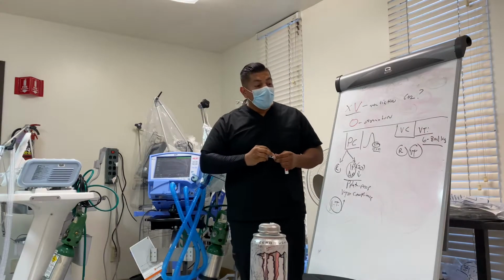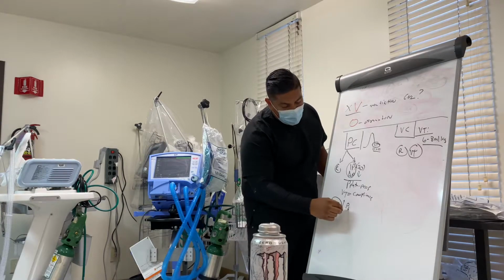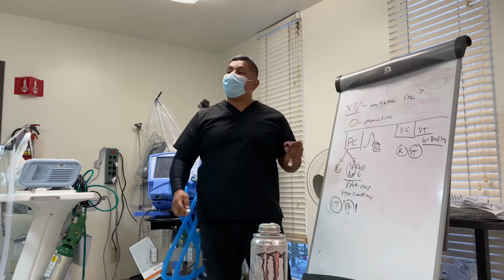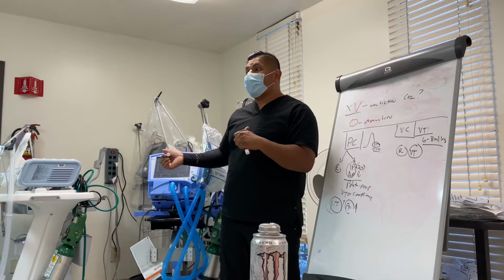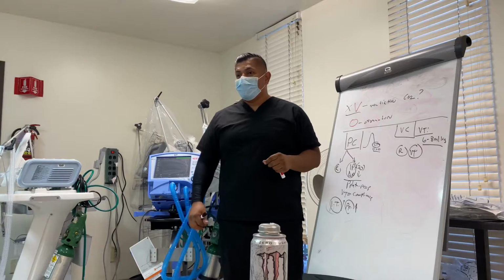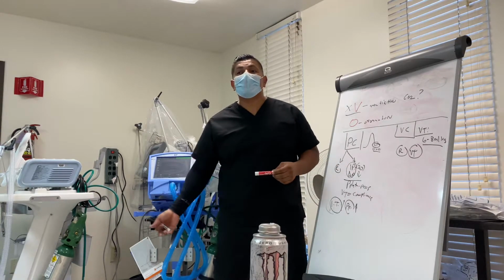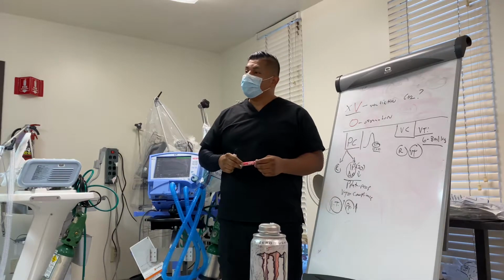And since flow at a high speed creates pressure, you want to lower peak. Flows are always high on I time. So if you have somebody that's septic, tachypneic, and cannot tolerate PRVC, switch them over to pressure control and it will synchronize even better, because their flow demands will always be met. Flow is constantly high, you're just controlling how long you're going to hold it for.